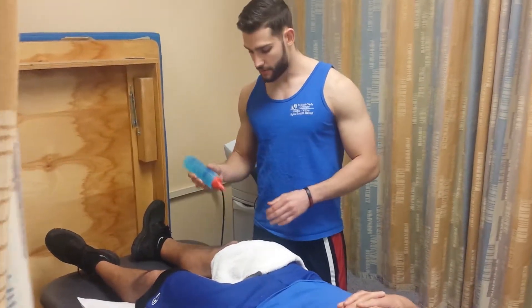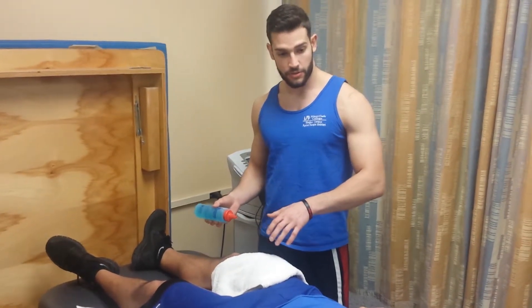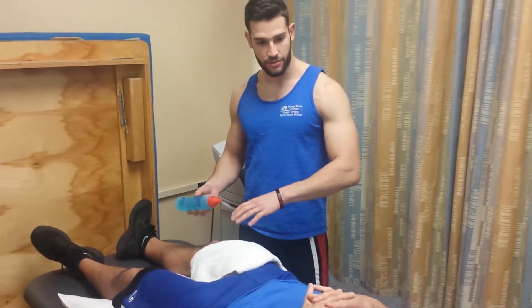So Dan, before we start, I'm just going to let you know that this gel may be a little bit cold. And when I'm using the machine on you, I want you to let me know if you feel any burning, aching, or any sensations. You shouldn't really be feeling anything.